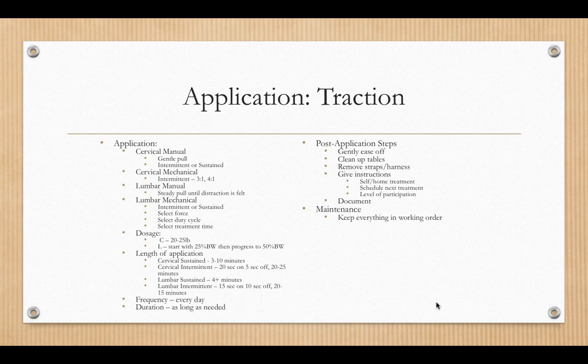Frequency, you can do it every day. Again, research doesn't really show benefits one way or the other. Duration, as long as it's needed. As long as we're gaining points on our patient-oriented outcomes, right? As long as they're getting better, we should continue to use it and always implement it with other modalities, specifically usually exercise. Post-application steps, gently ease them off.